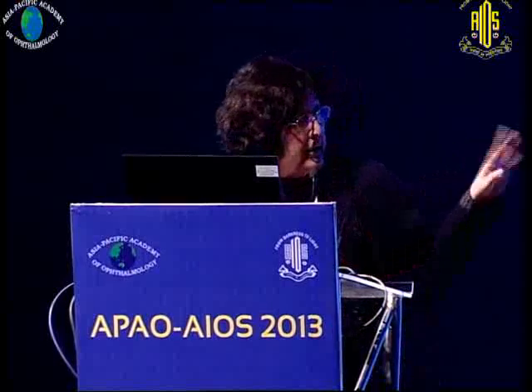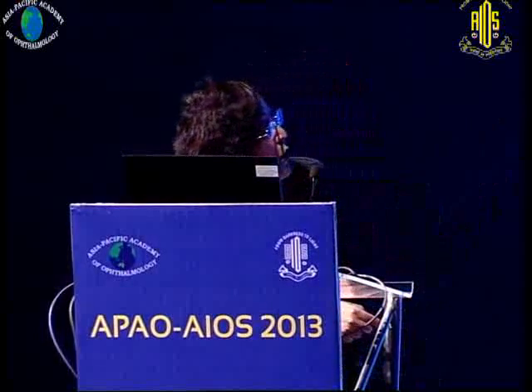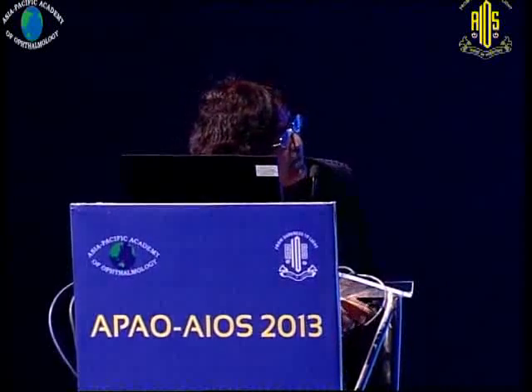These are my patients. I used vitrectomy with ILM peeling and SF6 tamponade, and treated 5 cases. In these 4 cases, over time the retina attached and it's getting better. The anatomic success is pretty good. 4 cases are up to 10 months with the retina attached.